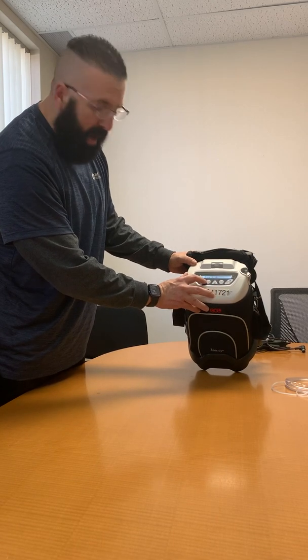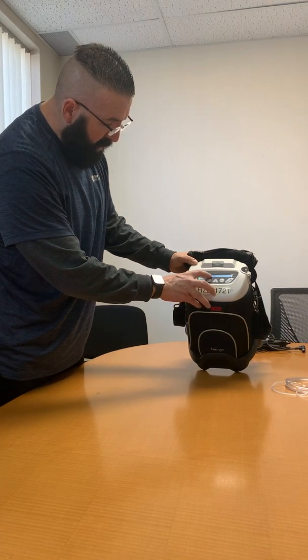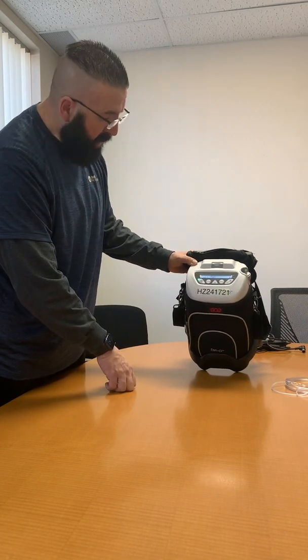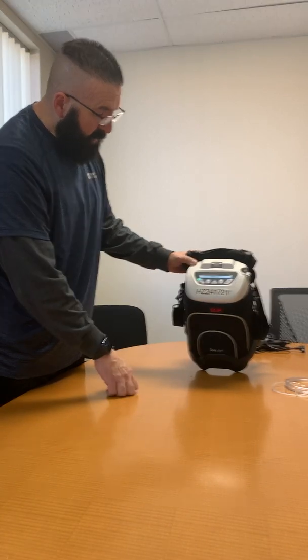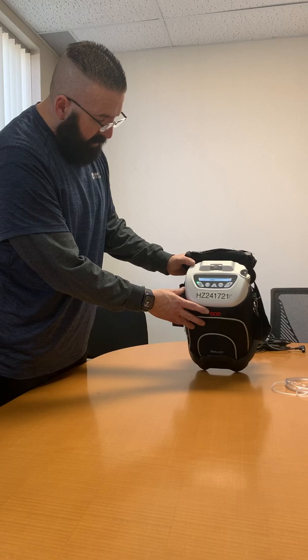Over here is your battery indicator. If you want to know how much battery life you have inside here, you're going to press that. You've got 70% battery life. It's going to take about 15 to 20 seconds, that'll go away and default back to the regular screen. And I just want you all to see that.